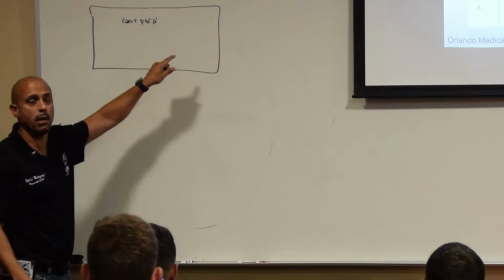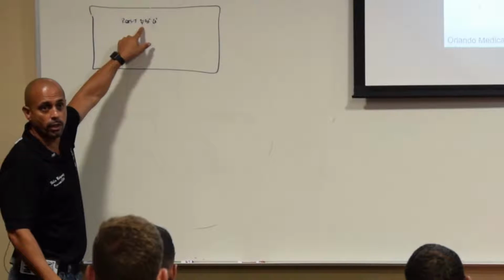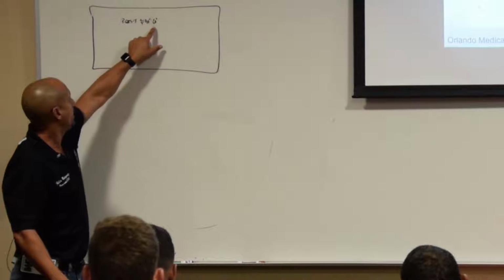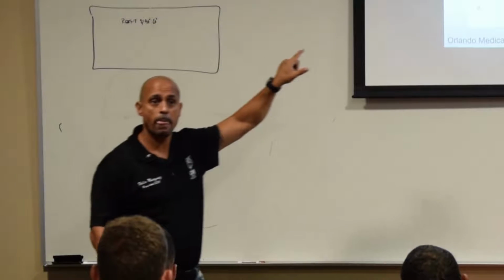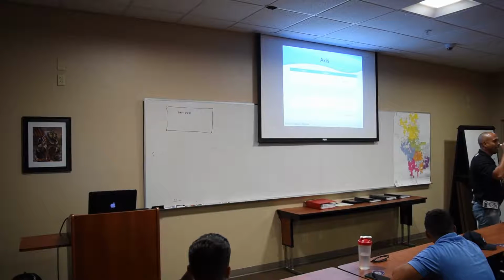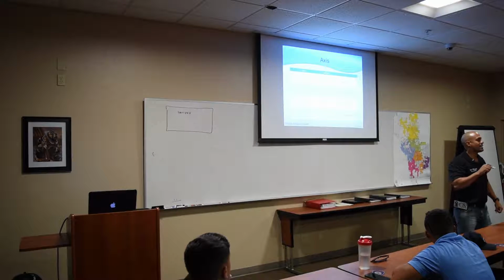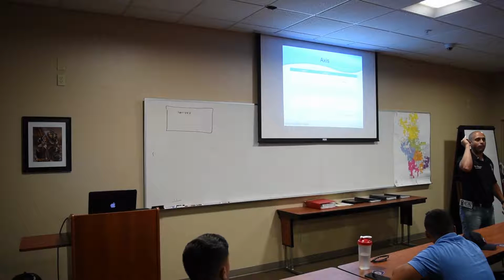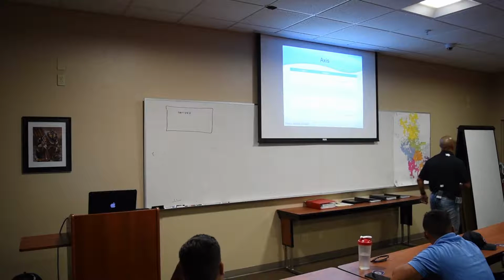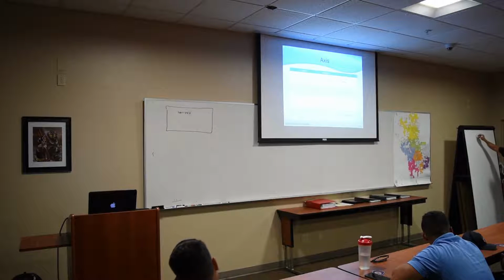You know why you got 3 different numbers? The first number, degrees, is for the P wave. The second is for the QRS. And then the last is for the T. Everybody with me? All we really care about is the QRS, the middle one. Look at that middle number. If it says positive 40, what does that mean? It's normal, right? Hey, I'll do this for you as well, just so you have a little reference.